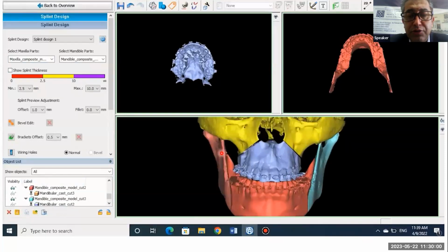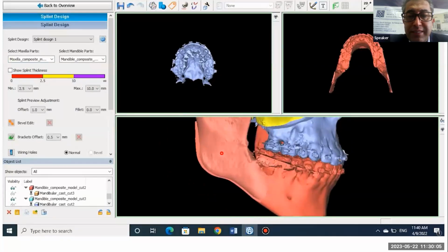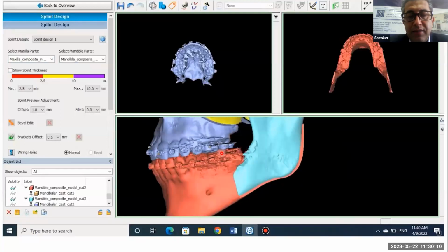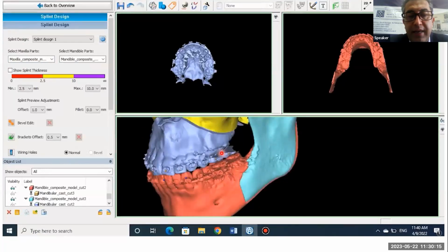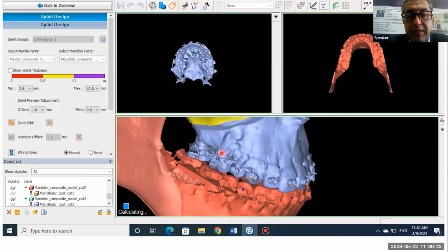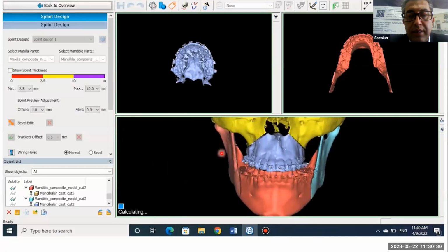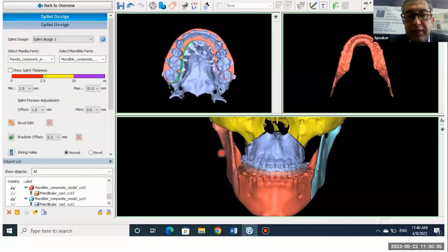In orthognathic surgery, we start with the maxilla, which means we can advance or set back the maxilla as much as we want, according to the treatment plan. So after repositioning the maxilla in any direction we want, we need an object to stabilize this new position. After stabilizing the new position, we can fix the maxilla to the mid-face. That object is a splint, an orthognathic splint. We name it the intermediate splint.